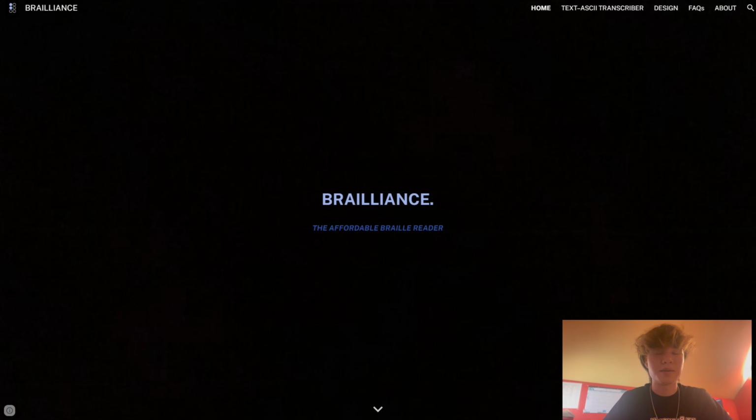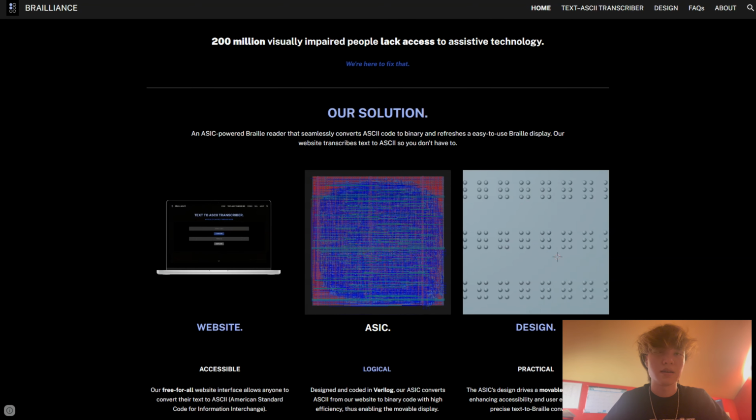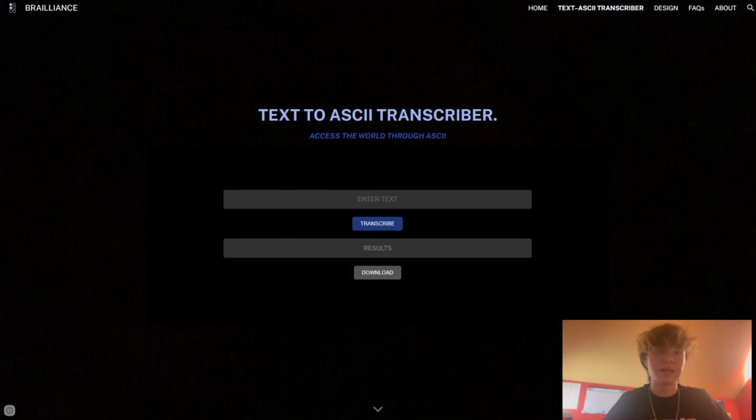Thanks, Savannah. I'm John, and I'm going to introduce the first phase of Brailliance, our website. Right now, I'm on our homepage where you can see some basic information about our processes. But next, we're going to move on to our text-to-ASCII transcriber. You can enter in any string of numbers, letters, or punctuation, and this tool will immediately convert it into ASCII. As Savannah mentioned earlier, this information will be sent to the ASIC chip and converted to Braille.